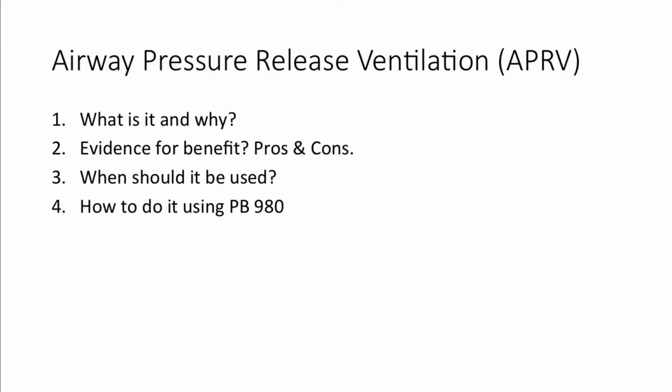So APRV is a mode of ventilation that people use for refractory hypoxemia. We don't use it a lot on this unit at the moment, but we might need to look into it. Some units use it all the time. Has anyone used it?